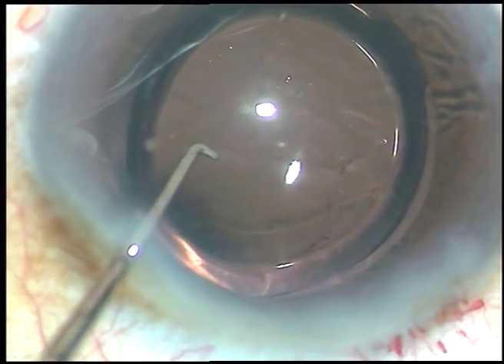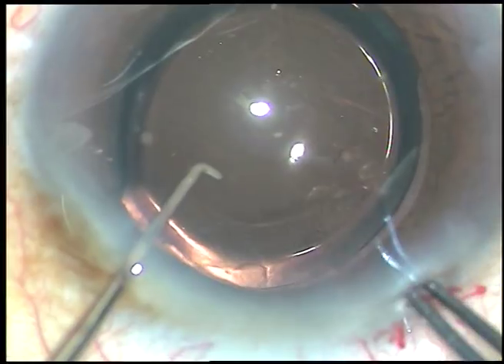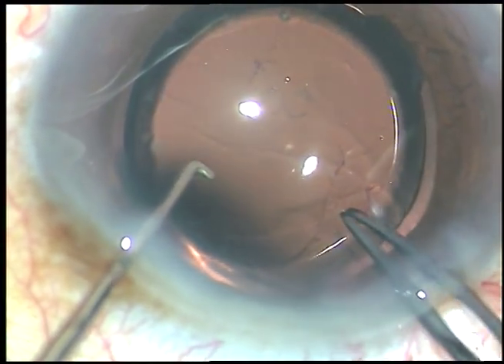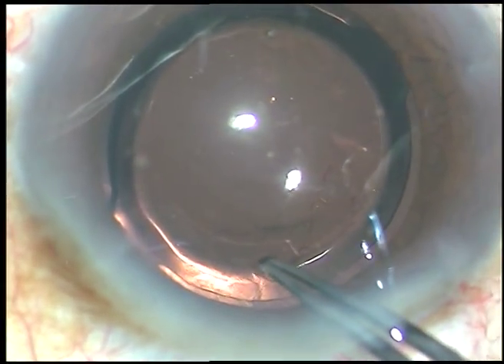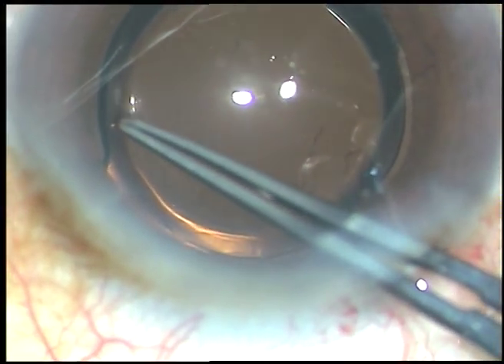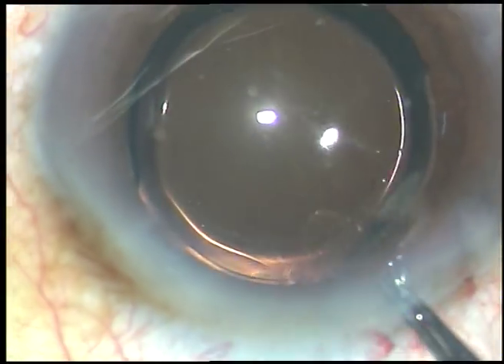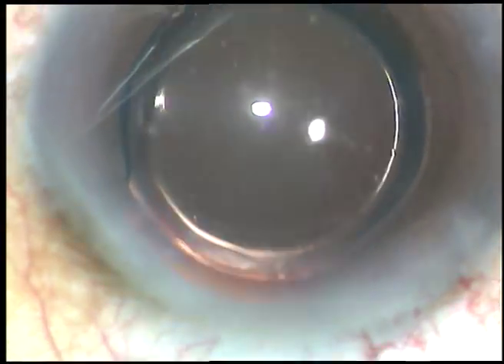I take the Utrata forceps, hold this capsular tag, and go clockwise very gently, and enlarge the rexis. See how beautifully the rexis has been enlarged.